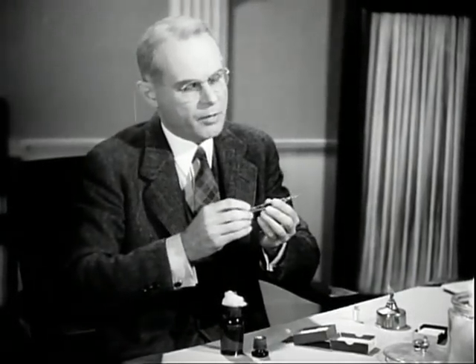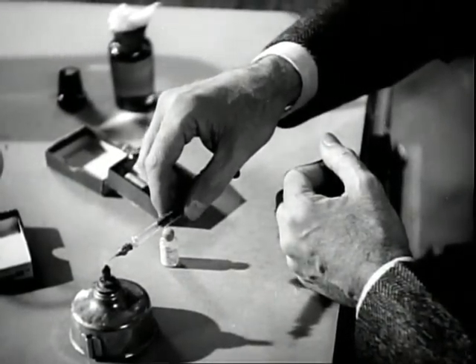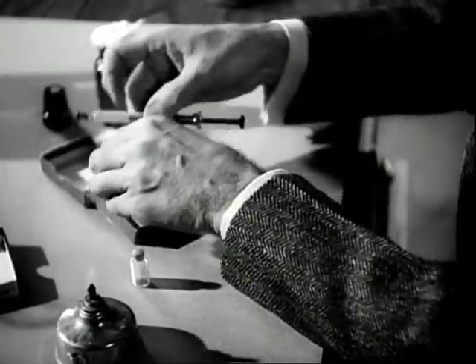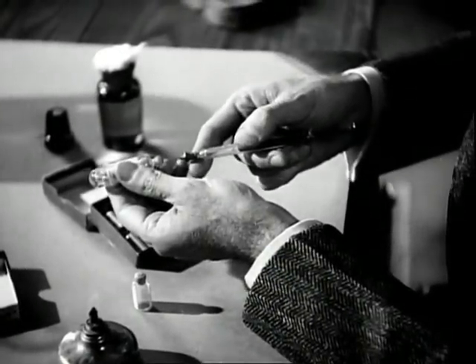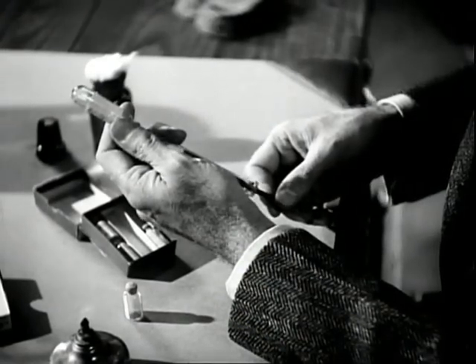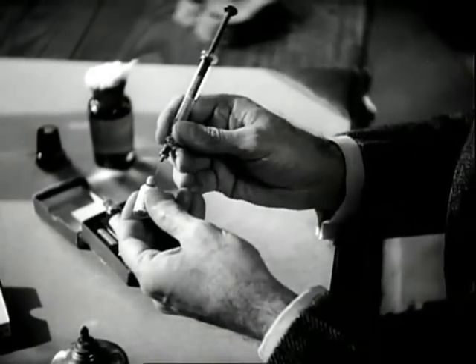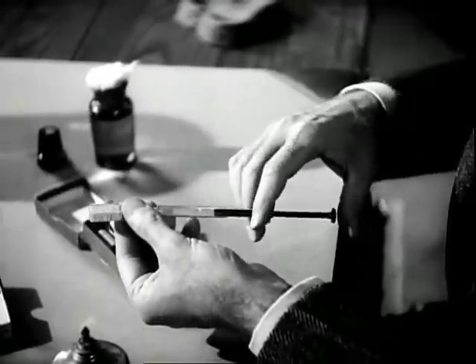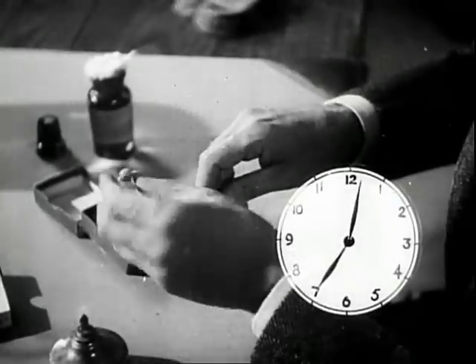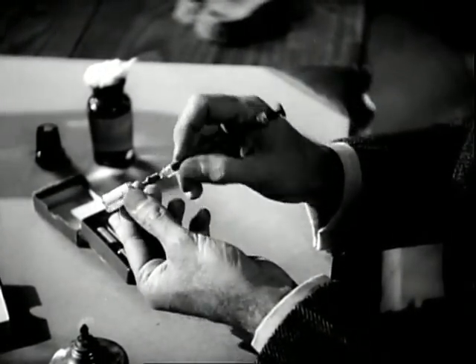Use a one cubic centimeter tuberculin syringe that has been sterilized. Inspect the needle for sharpness and flame it to make sure that it is sterile. Draw the sterile buffered saline solution into the syringe and transfer it with aseptic precautions to the bottle containing the tablet. Dissolve the tablet, then withdraw one-tenth of a cubic centimeter into the syringe.